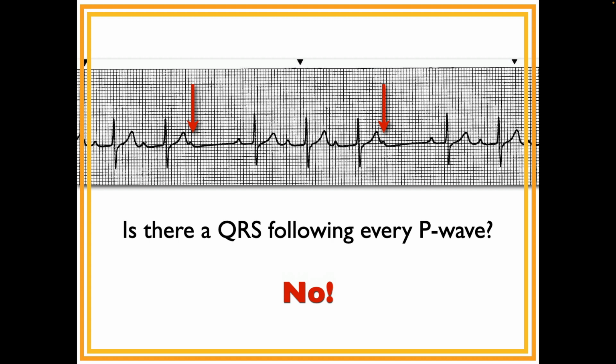The other answer is that even though this P wave is a little hard to see, precisely because what's happening here is the T wave and the P wave are not happening simultaneously, but almost, so that the side of this P wave has gotten cut off. But you can sort of picture how it should come down. You can see how it would be if the T wave isn't there. And if you look at all of these P waves, including the half-buried ones, they're the same shape, okay?